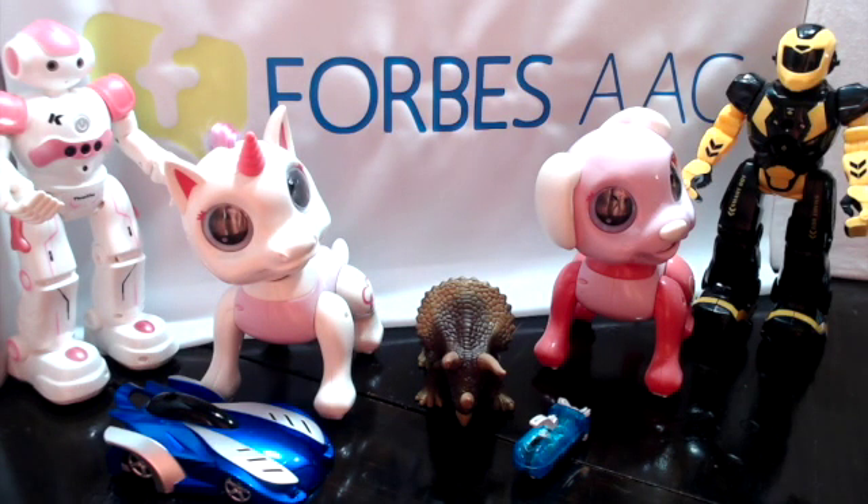Hi, my name is Bridget Gillermini and I'm an Assistive Technology Specialist with Forbes AAC. I want to share with you some of the infrared toys we've been exploring here at Forbes. We've paired the IR commands of the toy actions to grid sets on our new Windslate, which features an Adapta hub with built-in infrared. There are other infrared toys you can use with the Forbes Windslate, but we've tested and created grid sets for each of these toys.